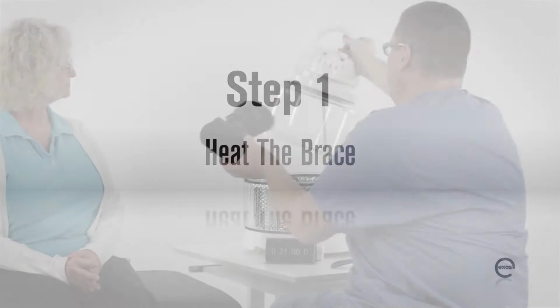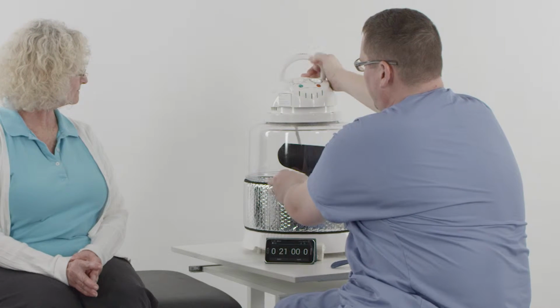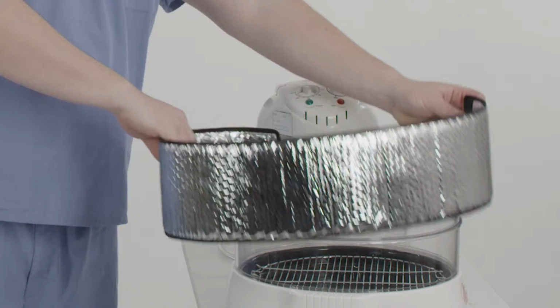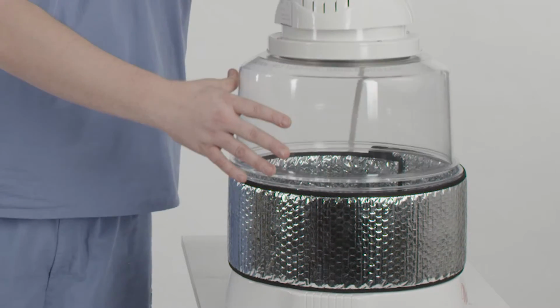Place the free motion brace in the Exos oven with footplate up. Make sure the top of the oven head does not come in contact with the brace footplate. Use the oven extension rings as needed for larger sizes. A thermal wrap is included with the extension ring kit, which may be wrapped around the 2 extension rings to ensure uniform heating of the brace.